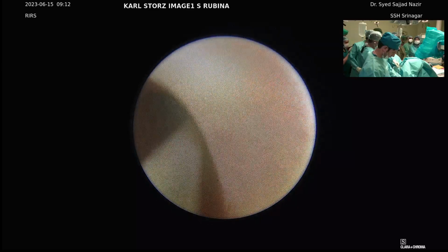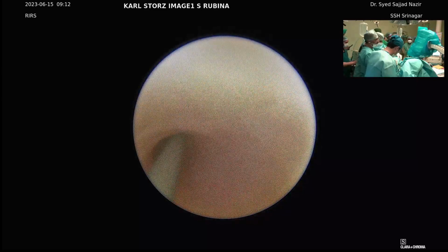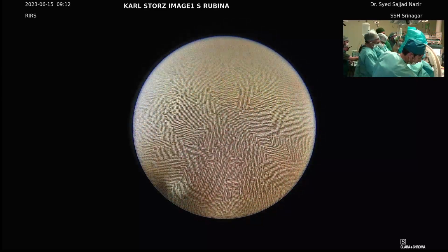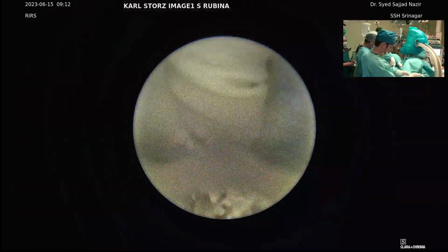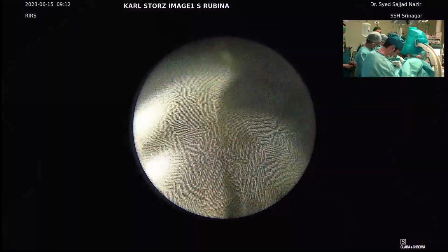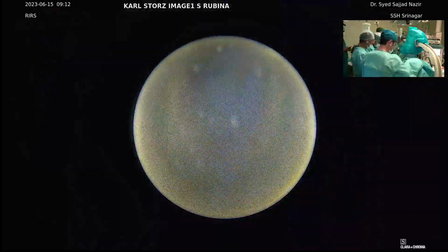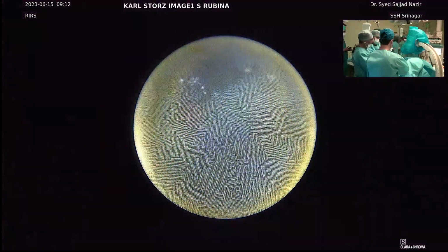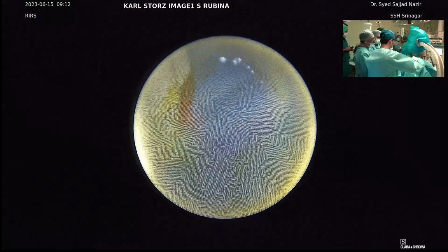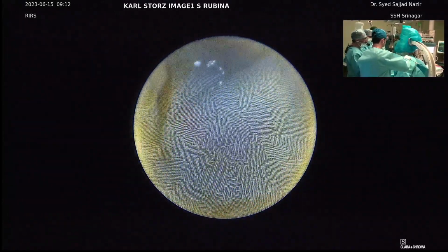Do you advise rigid ureteroscopy of the ureter before introducing your access sheath? Yes, definitely. Because even if you put a stent sometimes, the ureter is so tight that it might need to be dilated. Then you may see the condition of the ureter. And once we complete the procedure, we also come out after the sheath to see whether there is any damage or not. So you can know beforehand whether the ureter was damaged pre or post.